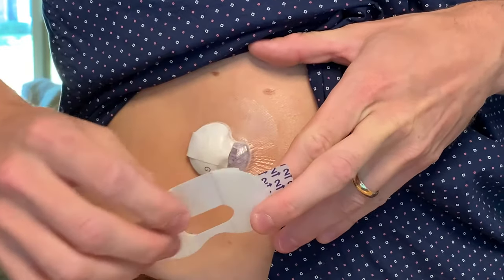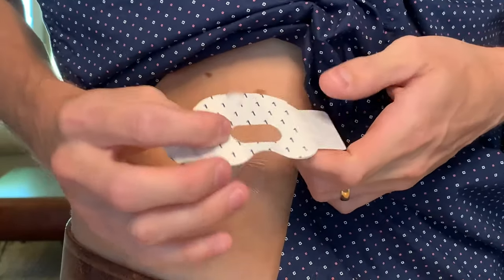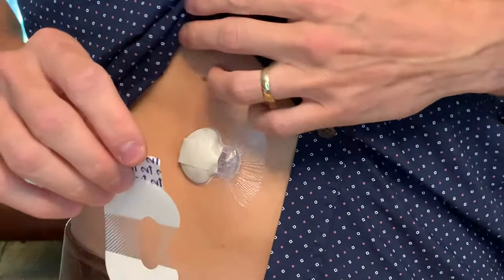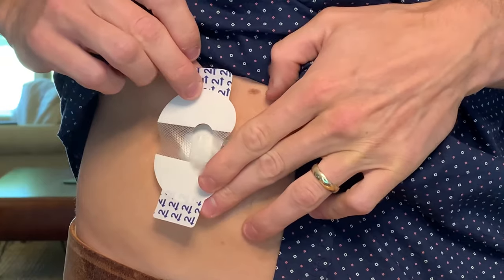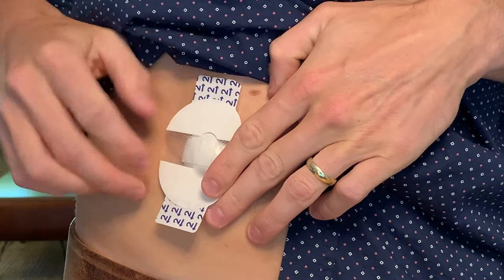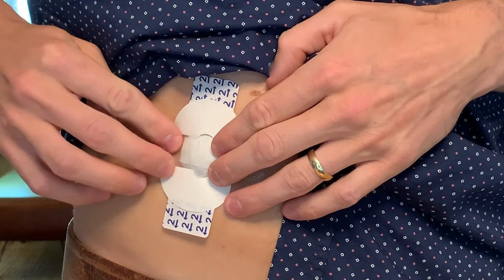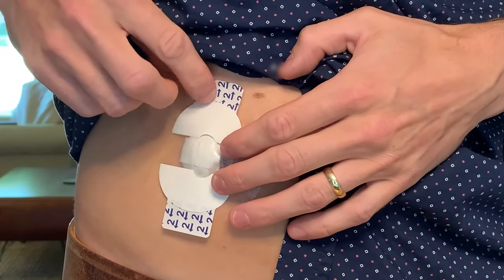Now I need the second piece of oval tape to help secure the transmitter. I'm going to peel off the liner with number one and hold the tape by the covered ends. This time, I'm going to turn the tape so the wide part covers about half of the transmitter and the rest covers my skin. I'll apply gentle pressure and then take off the tabs marked with number two and smooth it all down.